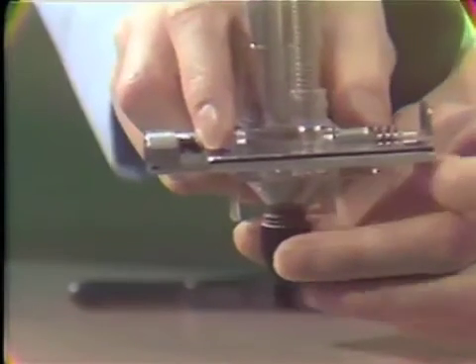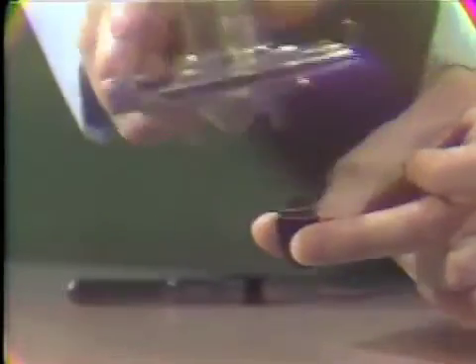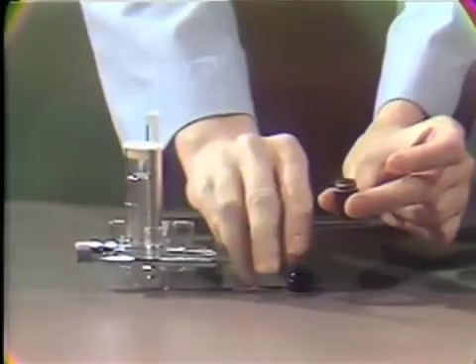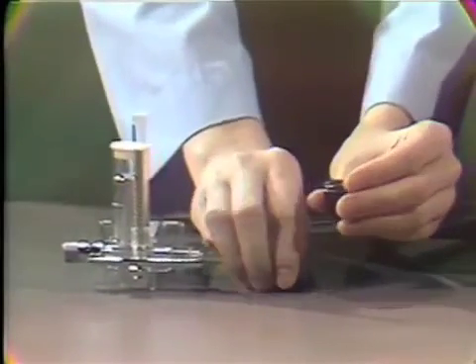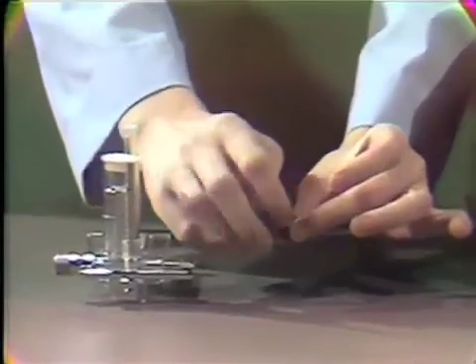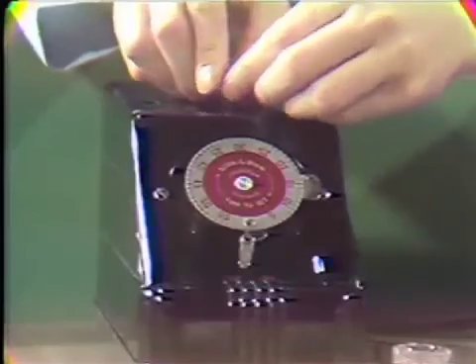This will ensure that the proper amount of mercury and alloy will be dispensed and also prevent spillage. Place the dispenser over the capsule, press, and release quickly. In this instance, a single spill has been dispensed. If a double spill is desired, repeat the process. Secure the top and place in the amalgamator. Set the timer and mix for 15 seconds.